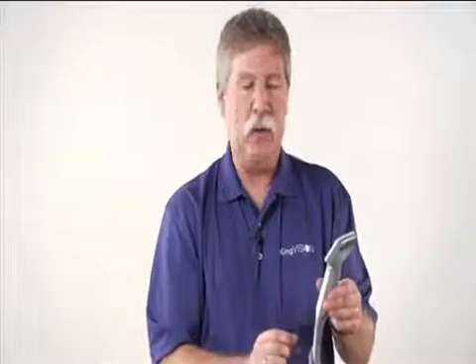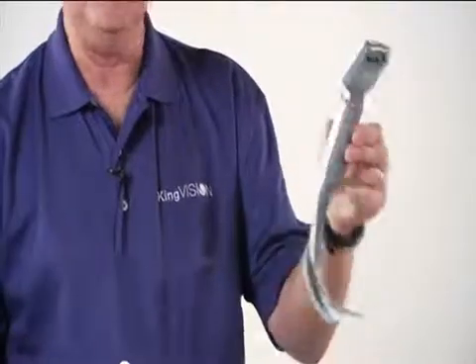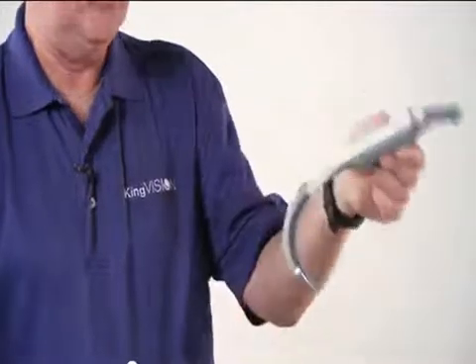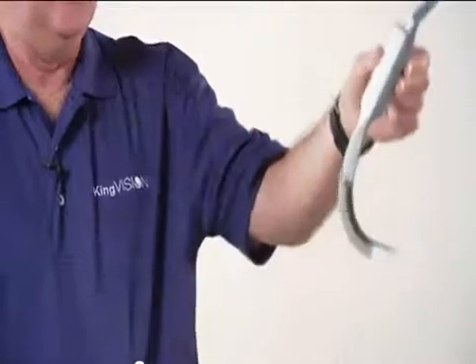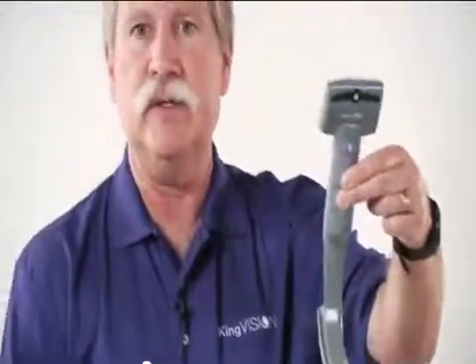So it's important to hold this in a way to avoid lifting on the display and disturbing this connection in use. We actually suggest that you only need to grab it with a thumb and your first two fingers. This gives you very good tactile feel as you're introducing the blade into the mouth. Also gives you very fine control if you need to manipulate it once in the mouth.